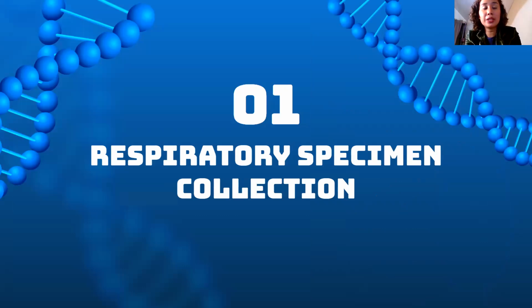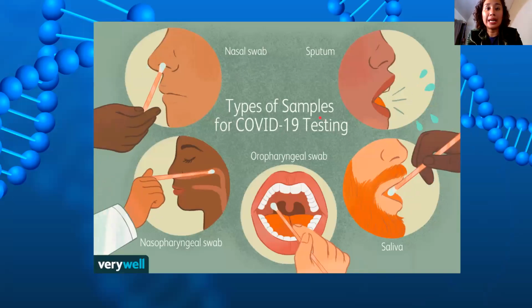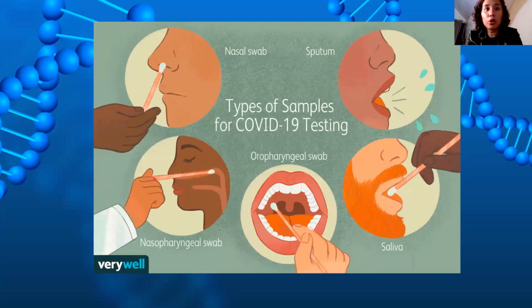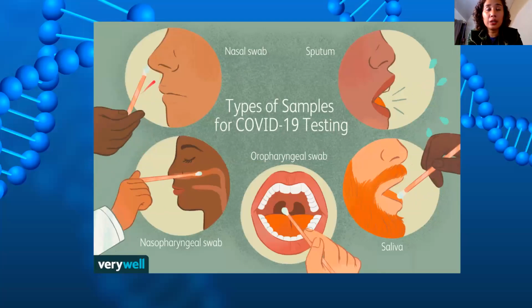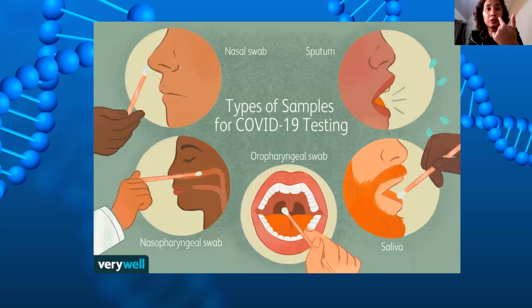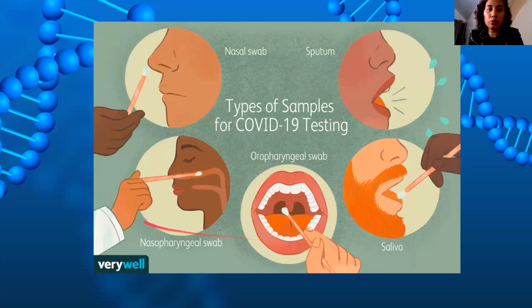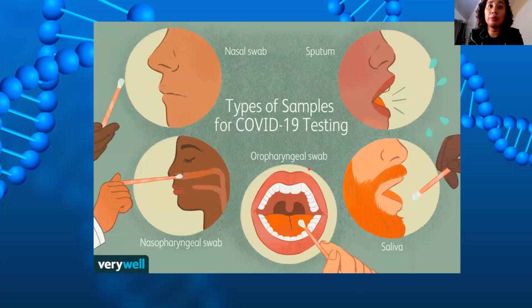So, how to collect respiratory specimens? Dito lang tayo magpo-focus. So, the common specimens are your nasopharyngeal swab and your oropharyngeal swab. Guys, simulan natin. Notice lang itong nasopharyngeal swab, the Q-tip or the swab goes straight. Ayan, straight po. So, we're not performing nasal swab, kasi ang nasal swab, pataas. Notice ang nasopharyngeal swab, diretso. Okay. So, yun yung gusto kong i-emphasize. So, itong nasopharyngeal swab, NP and OP, oropharyngeal swab, doon tayo mag-focus.